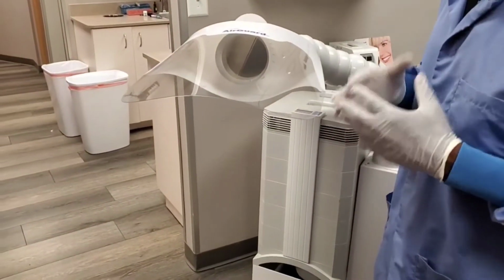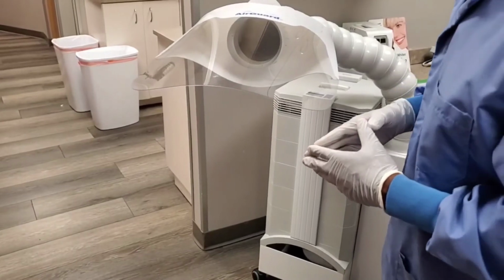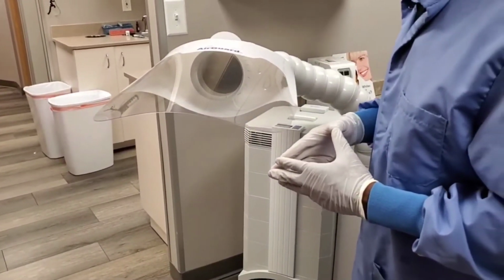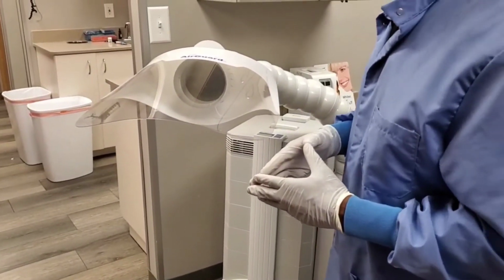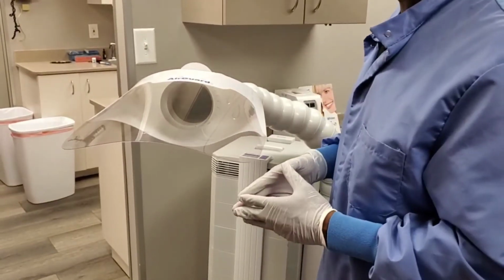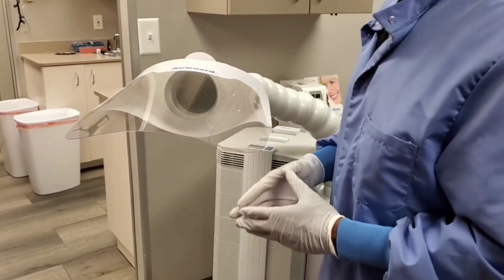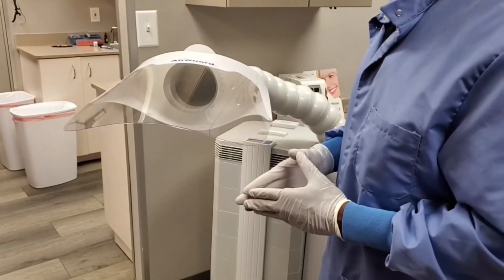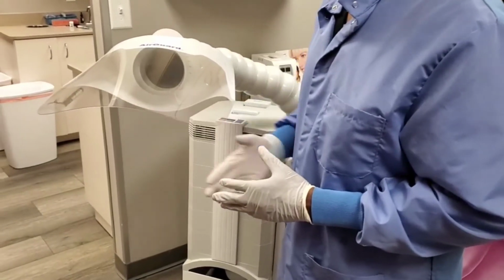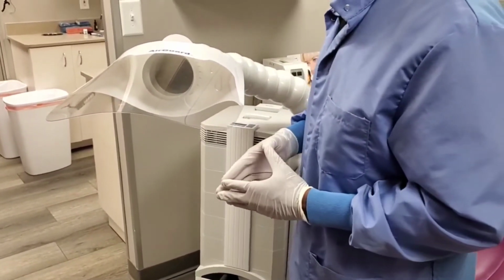Also, we have some patients here that work for the coroner's office, and sometimes they have to do autopsies on human cadavers, especially when they use a bone saw. The saw goes everywhere, the shavings go everywhere. So this can also be a barrier for doing cadaver dissections of human bodies. This can also be that barrier that helps protect the clinician in doing autopsies.